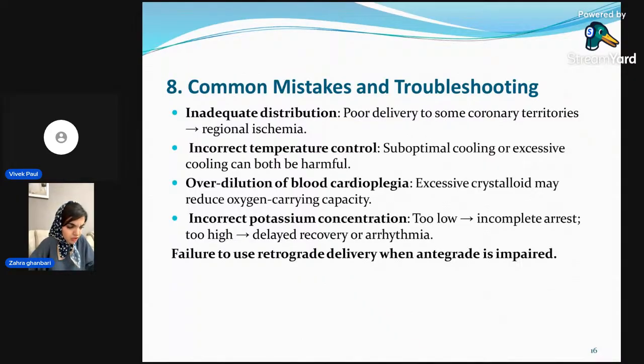And maybe you ask me how we can calculate the hemodilution. One of the factors that we can use to calculate this is tissue oxygen delivery, DO2, the amount of oxygen delivered to tissues per minute. It depends on pump flow, which means cardiac output, multiplied by oxygen content.